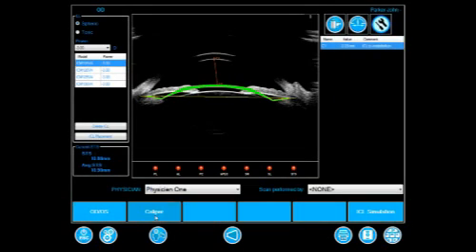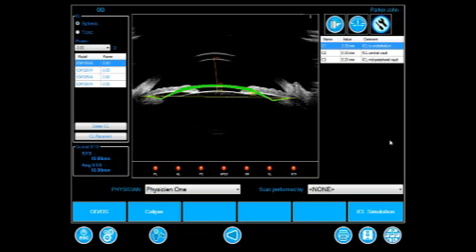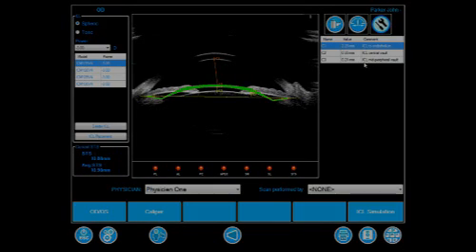Lastly, the caliper tool automatically determines the distance between the corneal endothelium and the implant as well as the central vault and the peripheral vault.